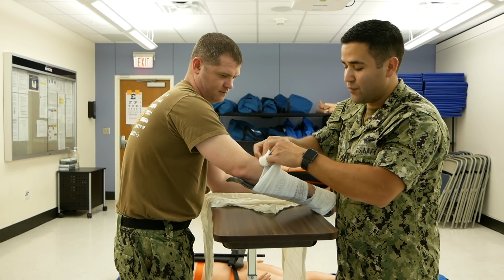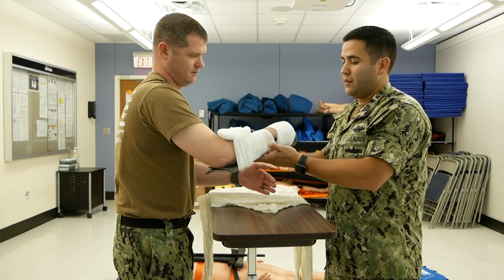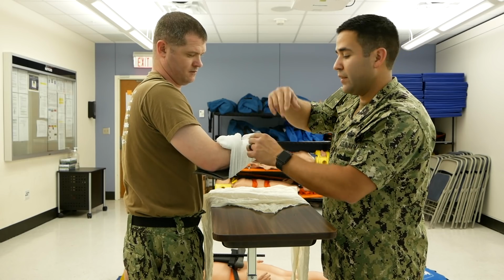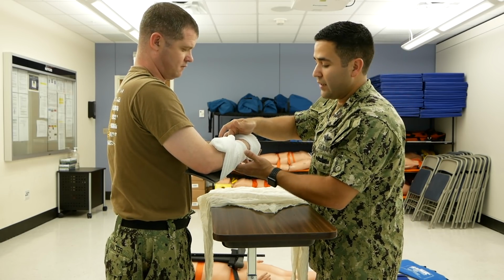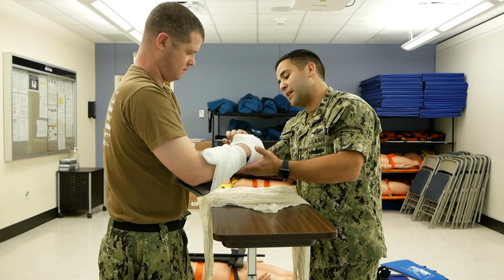Just tuck the excess wrap underneath for this one. And then you're able to check CMS once you are complete. You will not leave the excess wrap like this. You would cut it and tie it or tape it down. But for the lab, just go ahead and tuck it underneath and be able to check distal pulse as well as capillary refill to make sure the patient still has that cap refill.